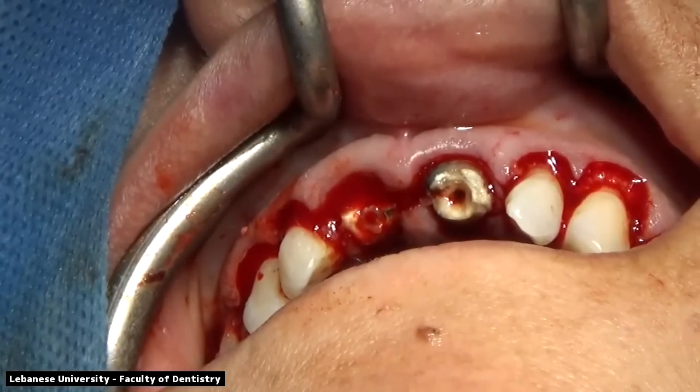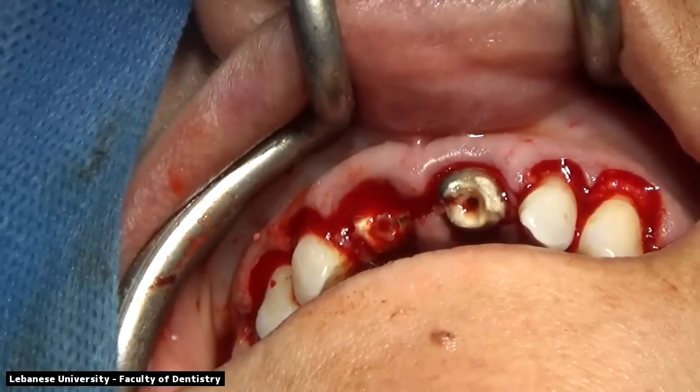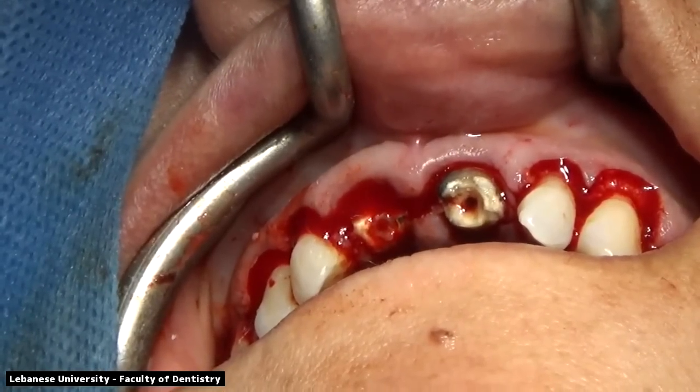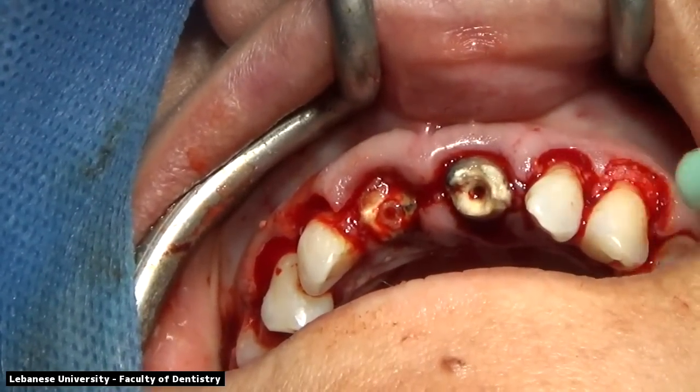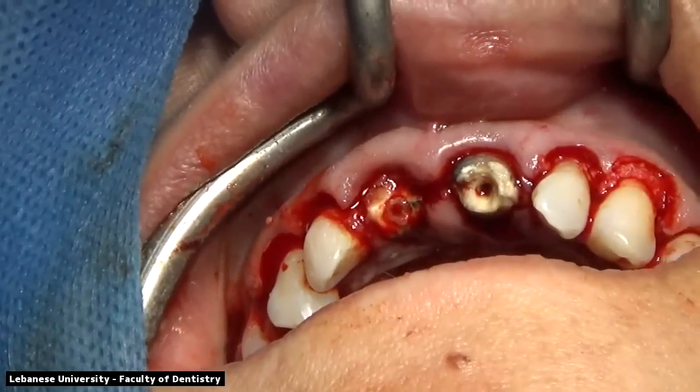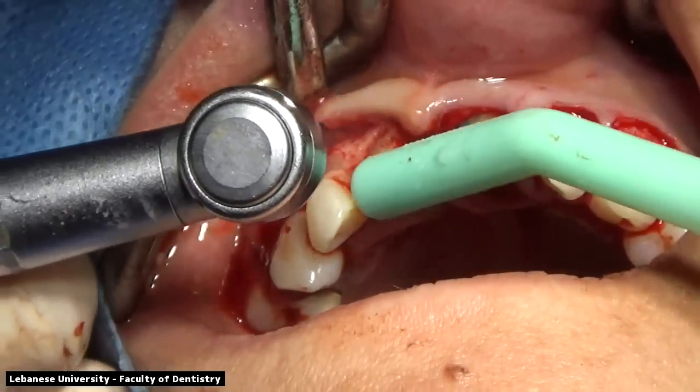In this case, we're going to be placing 2 tissue-level implants. And at the same time, since the gingival margin of the central incisor was higher than the canines on the right and the left side, a crown lengthening procedure was also decided. The crown lengthening will be done on the canine and lateral bilaterally.